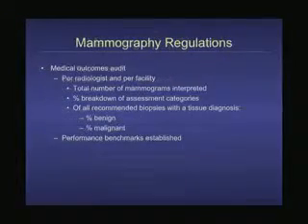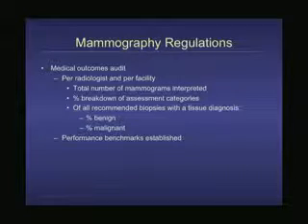This was a really good thing. Now, they also have us do a medical outcomes audit. So for every radiologist who reads mammograms at a certified facility and for the facility as a whole, we have to report how many mammograms we read, what we call each one of those categories, the percent that we call each of those categories, of things that we recommend for biopsy, where we are required to find out the outcome, determine if it's concordant, if it fits, what percent is benign, what percent is malignant, and they give us benchmarks that we have to be operating within this range, which again is a good thing. So we know that people out there are doing a good job.